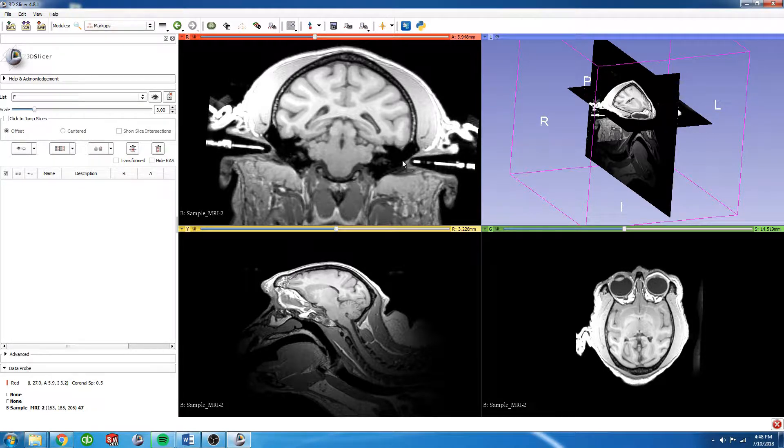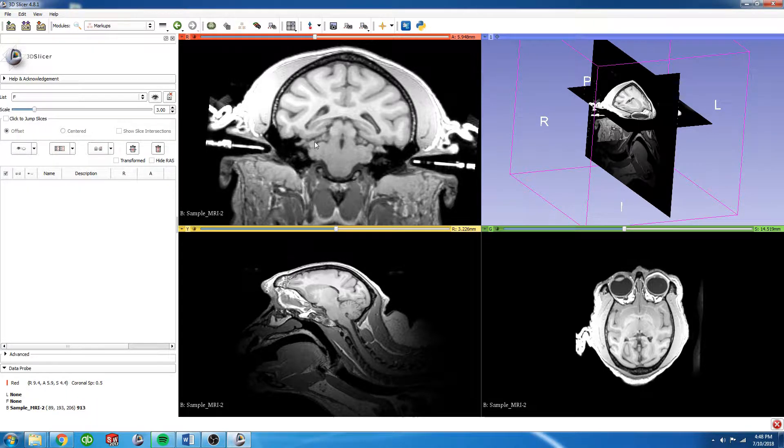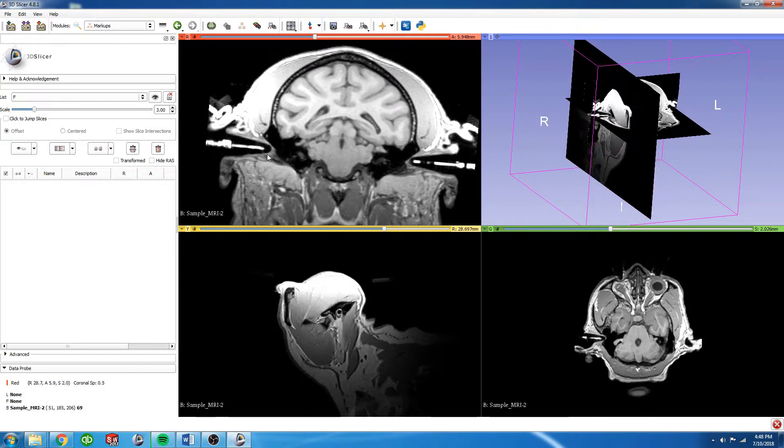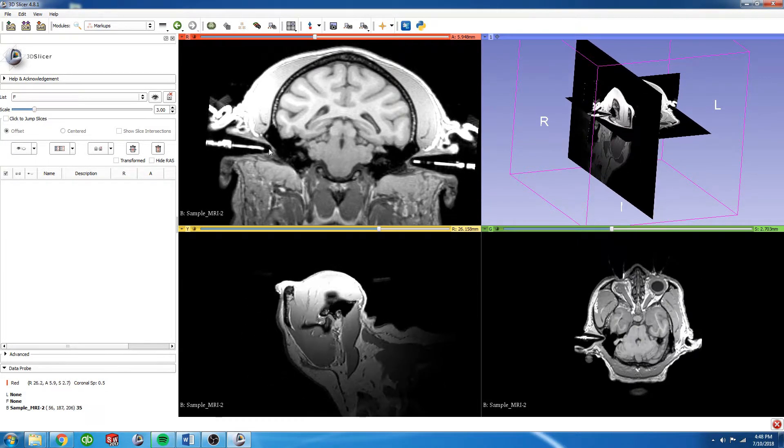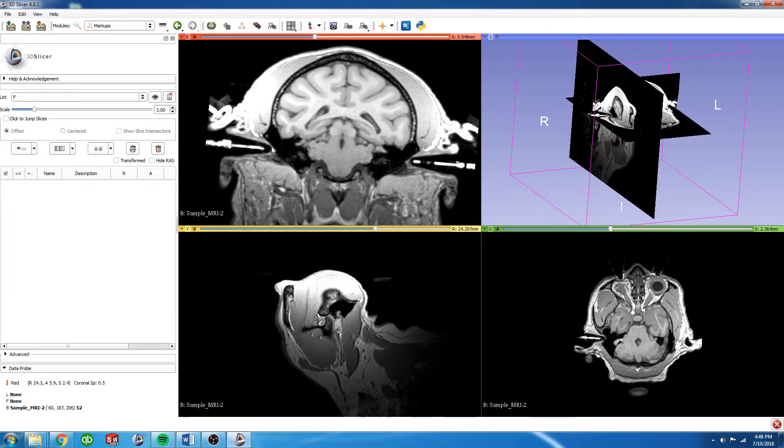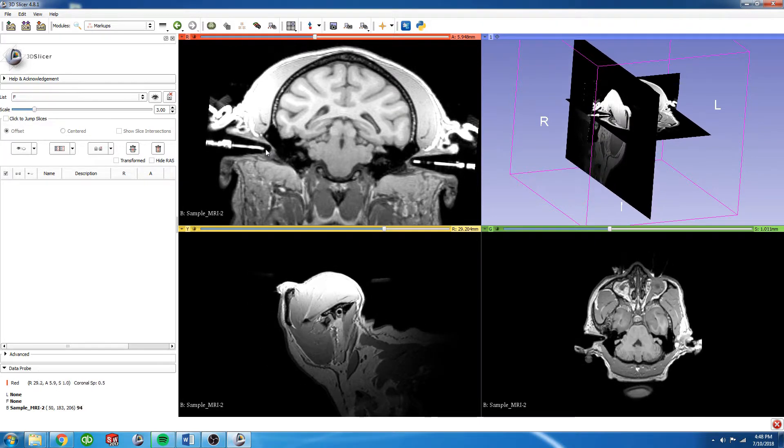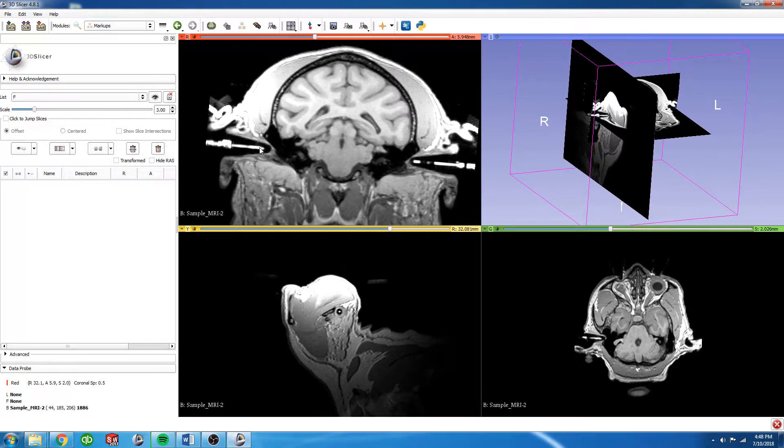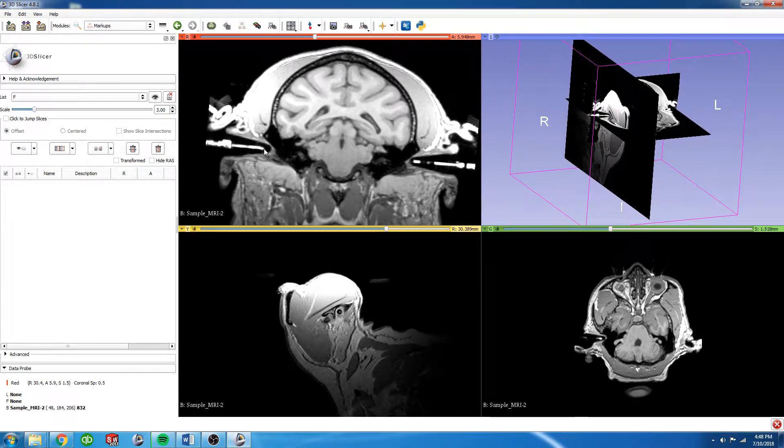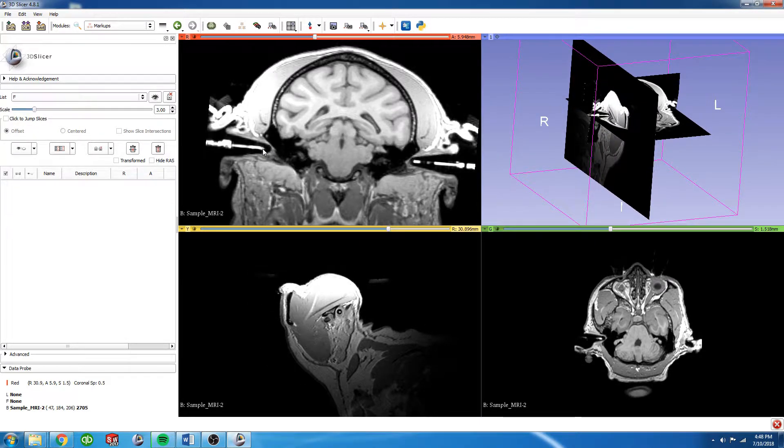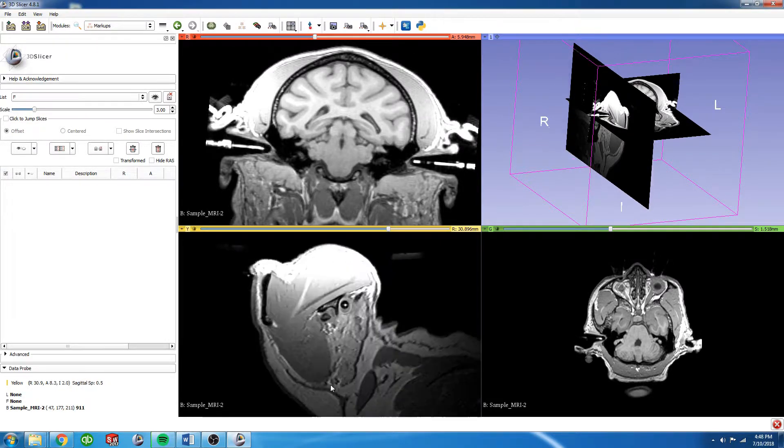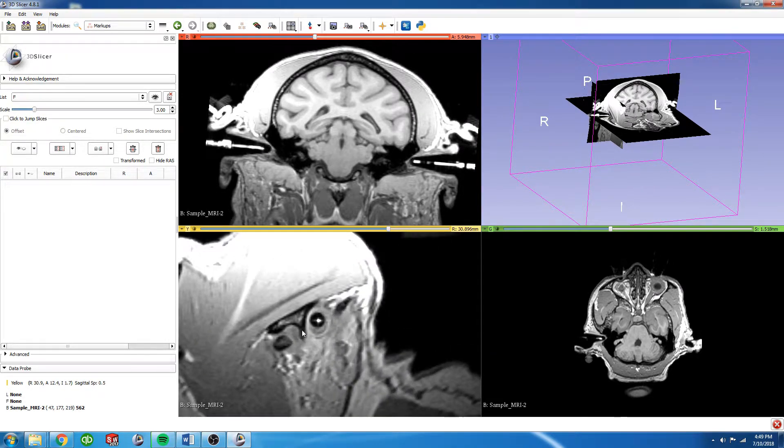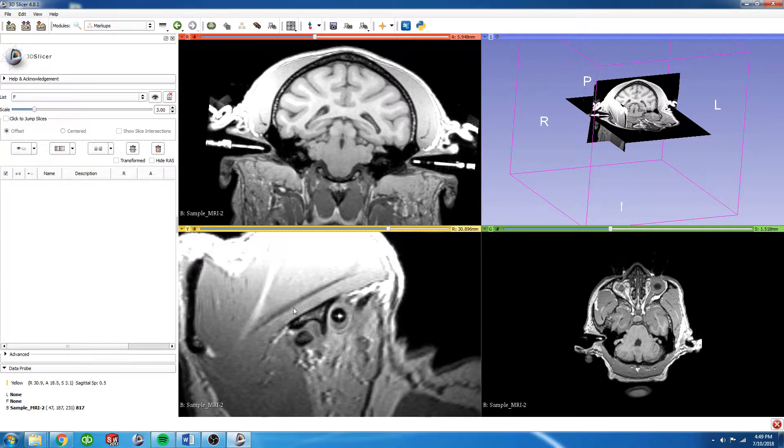Another helpful thing we can do now is by holding the shift key and moving my mouse over one of the views, I can change the other two views to show where my mouse is in that space. So if I hover over the tip of this fiducial ear bar, you'll see that I can see it in the sagittal view, which is another point of reference.